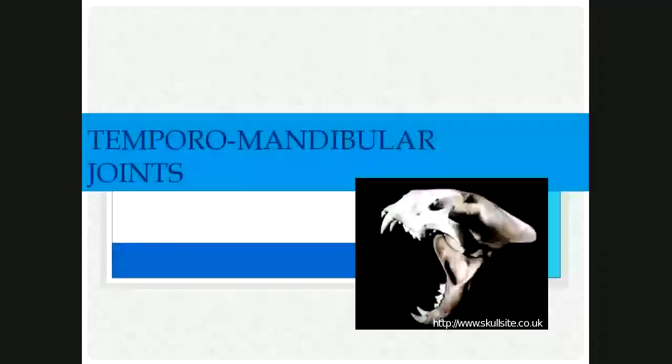All right, the temporomandibular joint is aligned obliquely to the median plane of the head. So on a lateral radiograph, it's not seen properly because it's not seen end-on. One needs to tilt the nose of the dog so that the joint space is brought into a vertical position, making it parallel with the X-ray so that it will become visible. The TMJ closer to the cassette will be demonstrated. So if the patient is lying on his right side, the right one will be demonstrated. But usually we radiograph both sides for comparison for pathology.